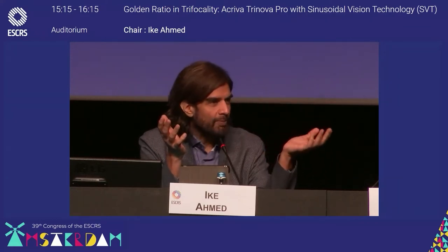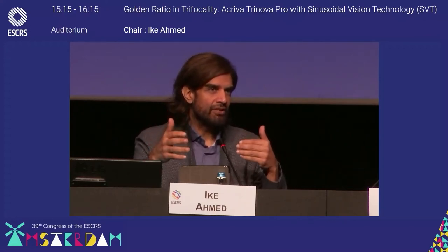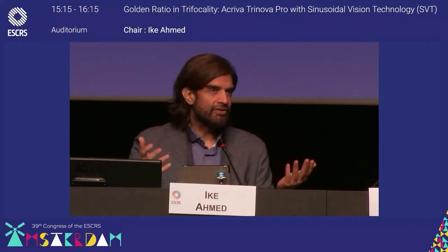We do that because of compromises with lenses. And if the lens technology has the right light transmission, addresses dysphotopsy, and has excellent distance vision, then maybe we don't need to do those compromises. And I think that's what perhaps this can do.